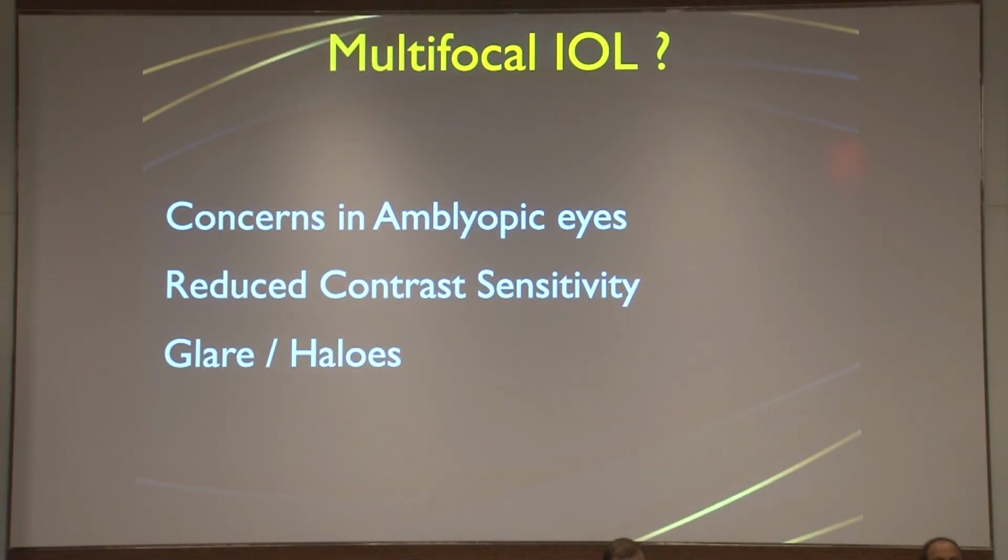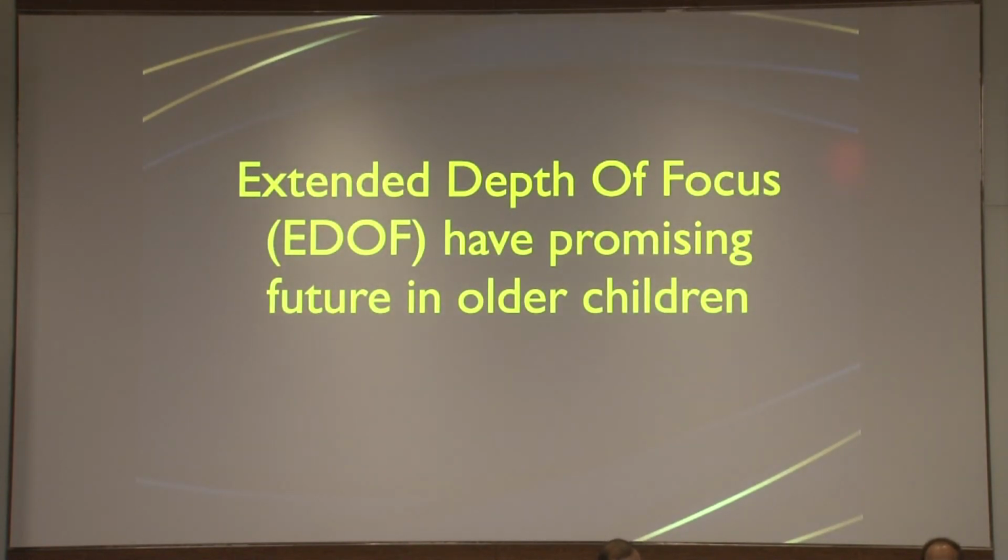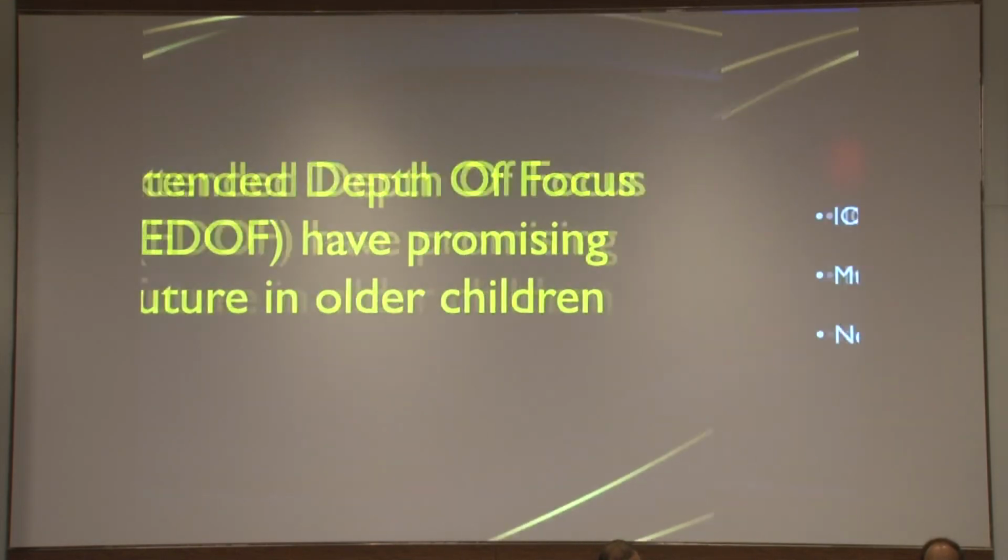Multifocal IOLs are something that we discourage, because here our aim is not refraction, our aim is to give good quality vision. And it's very surprising that it's only we grown-ups who are so concerned about glasses. Children, even if you give them +12, +15 glasses, if they can see well, will adapt so easily that getting children to wear glasses is generally never an issue. With the advent of extended depth of focus IOLs, maybe in older children this is something we may consider in times to come. But as of now, we have no experience to really talk about it.